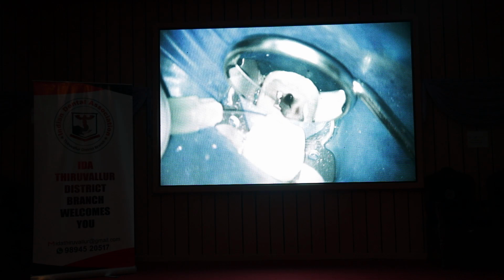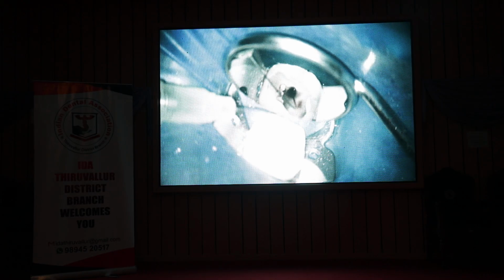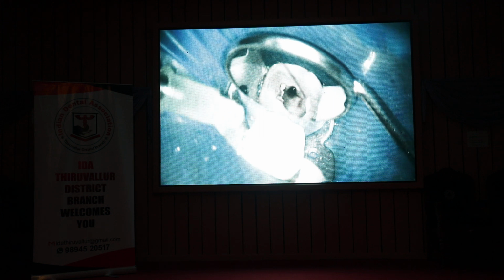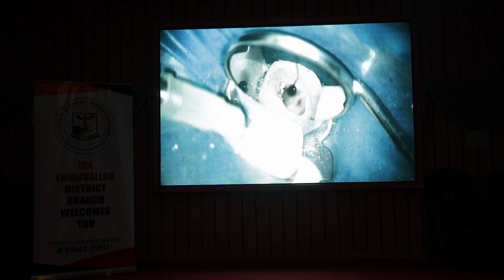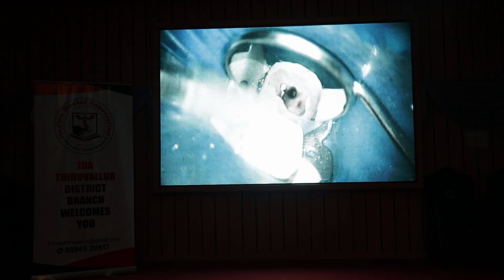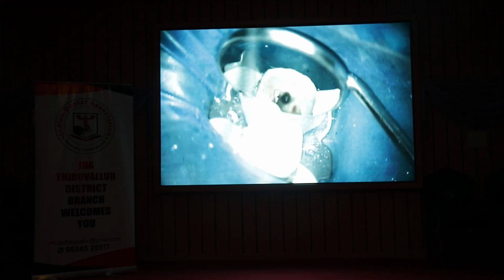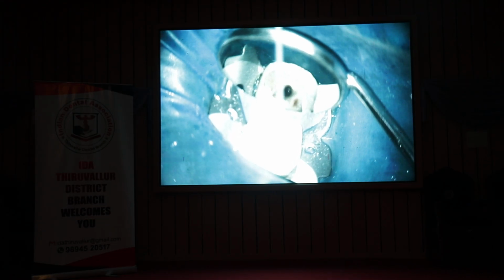Okay, so here I am trying to use the loop after I have enlarged the canal. I tighten it around. Okay, I am trying to get the grip of it. Okay, you can see the silverish part there. Okay, there I have removed it. I'll just show you this. You can see the instrument is there on the loop.